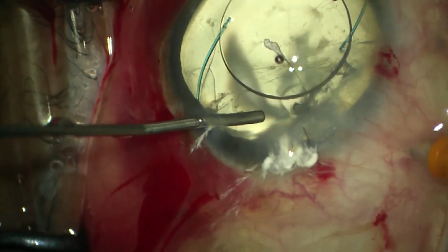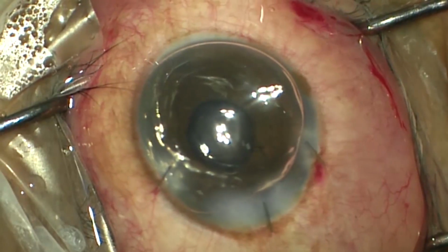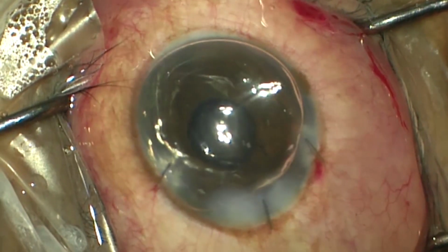It's important to keep in mind that the eye has to be kept firm before making the entry. In case a larger entry is made for a 20 gauge needle, then the port has to be sutured and cannot be left sutureless.